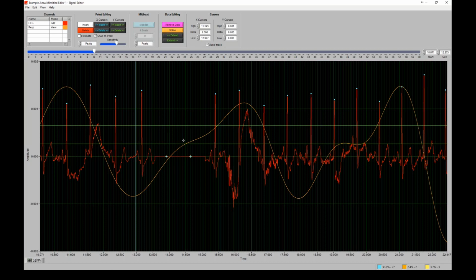But again, just to reiterate from earlier, you want to make sure if it's an arrhythmia that it wasn't some arrhythmia that reset normal sinus rhythm, in which case you'd have to delete all data on one side or the other, or you'd want to go through and do the rest of your data editing before coming back to this instance and reviewing it for correctness or for whatever else you might need to do to it.